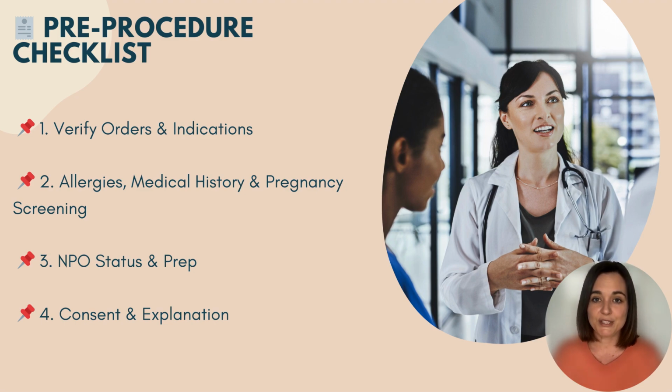Third up, NPO status and prep. Most procedures require the patient to be NPO for 8 hours, no food, drink, gum, or smoking. This reduces the risk of aspiration and improves image clarity. For barium enema procedures, prep might include a bowel cleansing agent the night before. If they didn't do it, you'll know by the scout image.